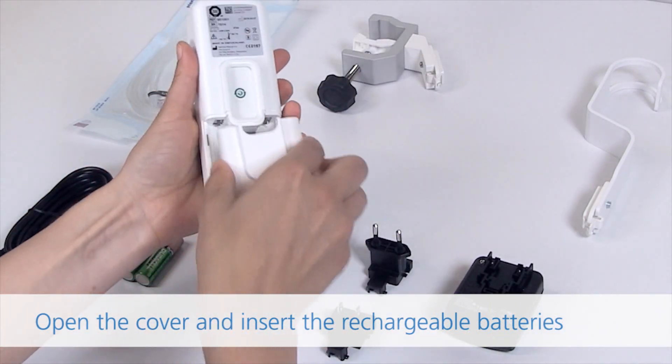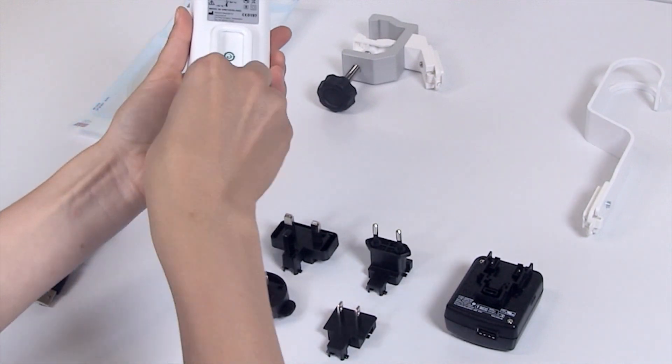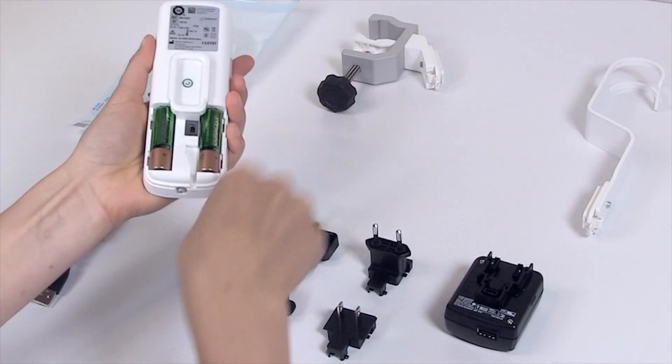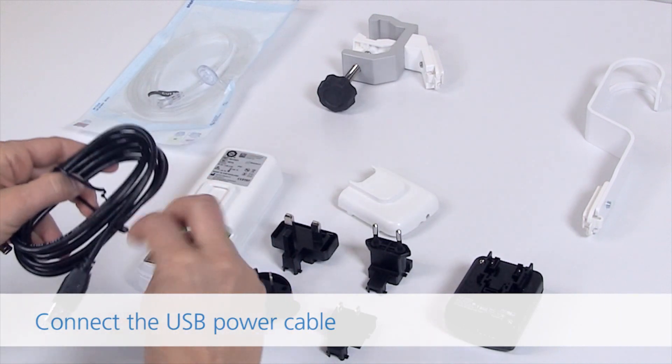Open the cover and insert the rechargeable batteries. Connect the USB power cable.